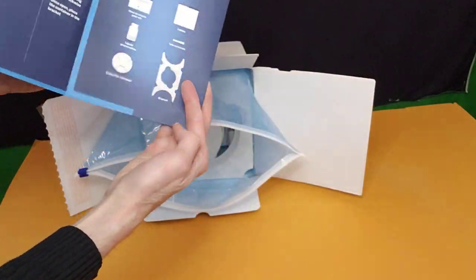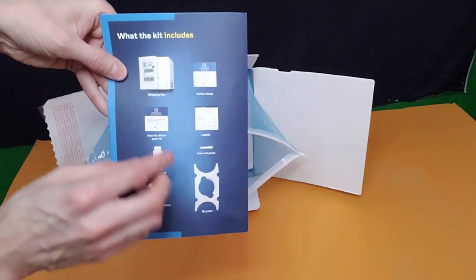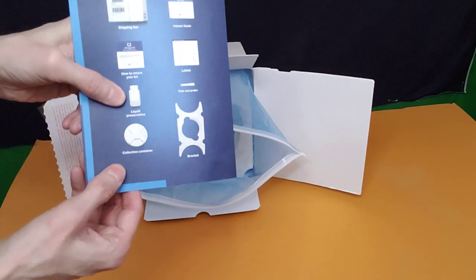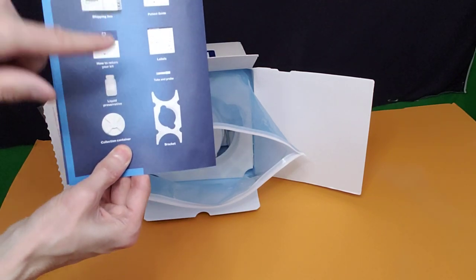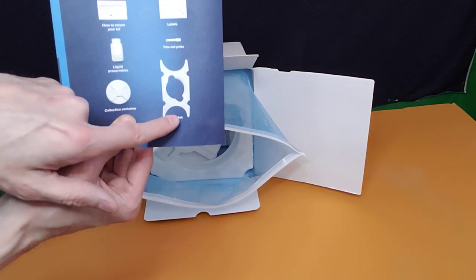So that's it — now let's get into looking at the items. What should come in this box: you have the shipping box, how to return your kit, liquid preservative, the collection container, patient guide, labels, tube and probe, and the bracket.